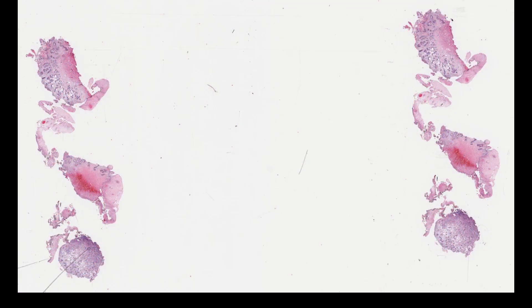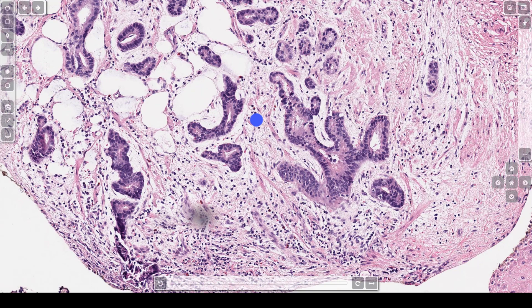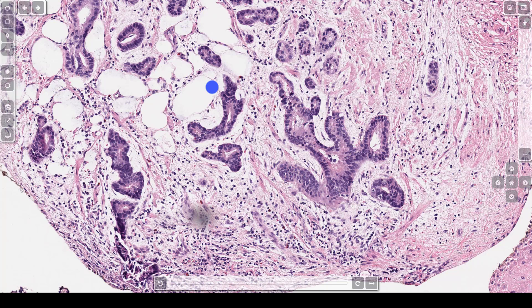This is the same patient at a later time point. At this power, you can see the nuclei are very atypical. In addition, you have a very irregular outline of the glands. Also, there are bits of smooth muscle around the glands — if you see smooth muscle around the glands, it means the glands are invading into the muscularis. In addition, there is some adipose here on the left, which is also evidence that these are invasive glands. This is adenocarcinoma arising in Barrett's esophagus.